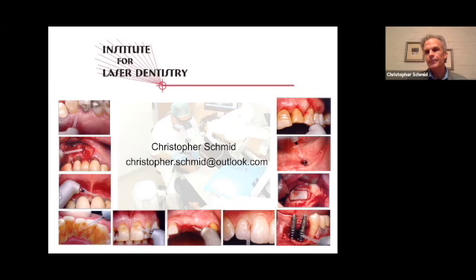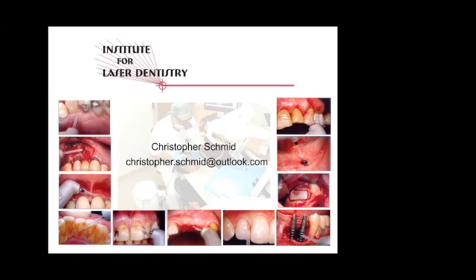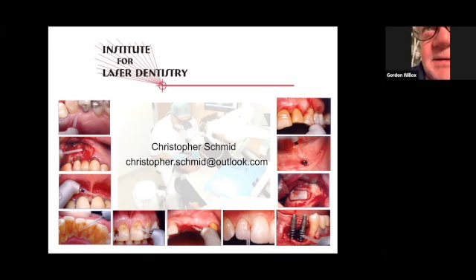And what about calibration? Calibrating the laser. Well, how do you know? After a while, does it not lose anything? Yeah, no, it's self-calibrated. In other words, there's an internal power meter which constantly calibrates it, so you know exactly what energy you're getting at the distal end of the articulated arm and the tip. But like any technology, any laser, once a year, what we do and what most companies do is have a technician come and do preventative maintenance on your laser for an hour or two, just to check the calibration. But they're self-calibrating. Okay, thanks very much.